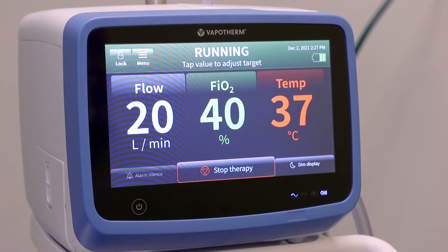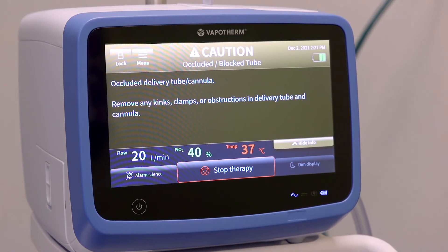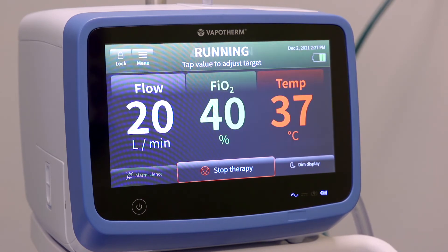When an alarm occurs, you will hear the corresponding series of beeps. Tap the more information button and the on-screen instructions will guide you through troubleshooting the issue. Once resolved, therapy will resume.